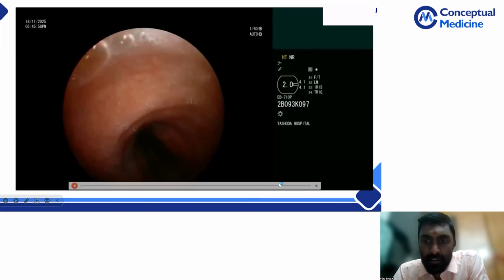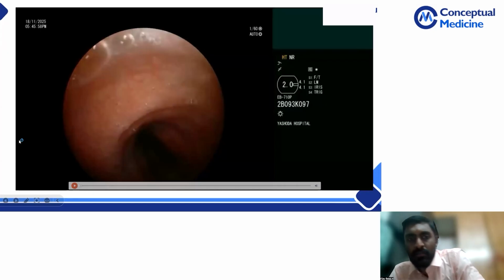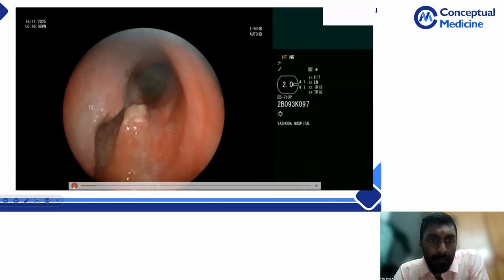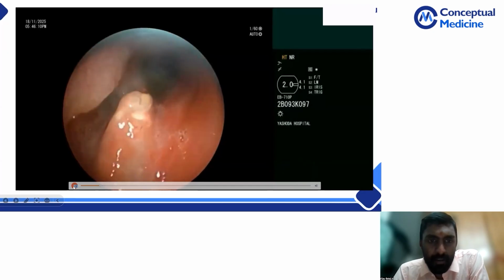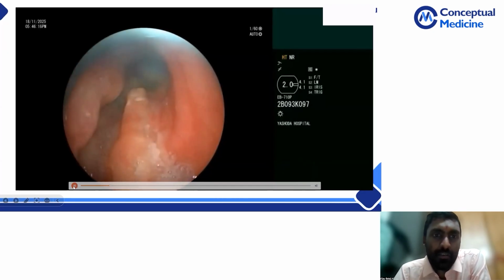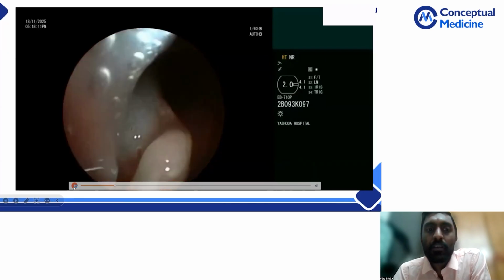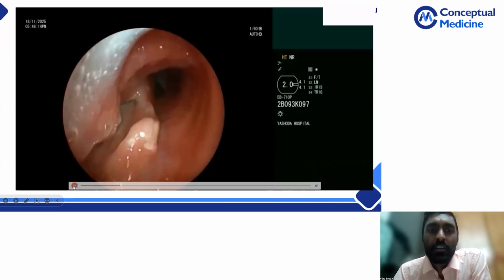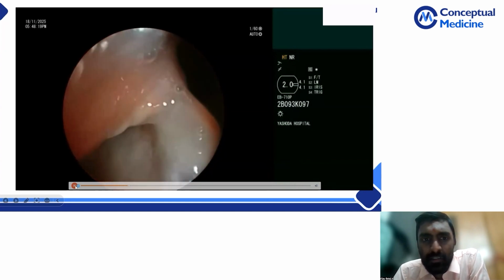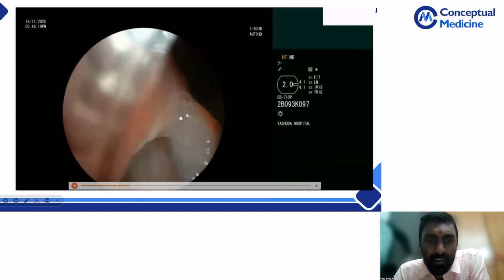This is something very interesting. You see, this is so you're doing a bronchoscopy. If you're not in bronchoscopy, it is difficult to identify. So what I'm seeing here is the fistula that is there. Okay, so you'll identify it based on some techniques that you see here. This is the carina you're seeing. If you see more properly, you will see this is the esophagus. Okay, the esophagus.